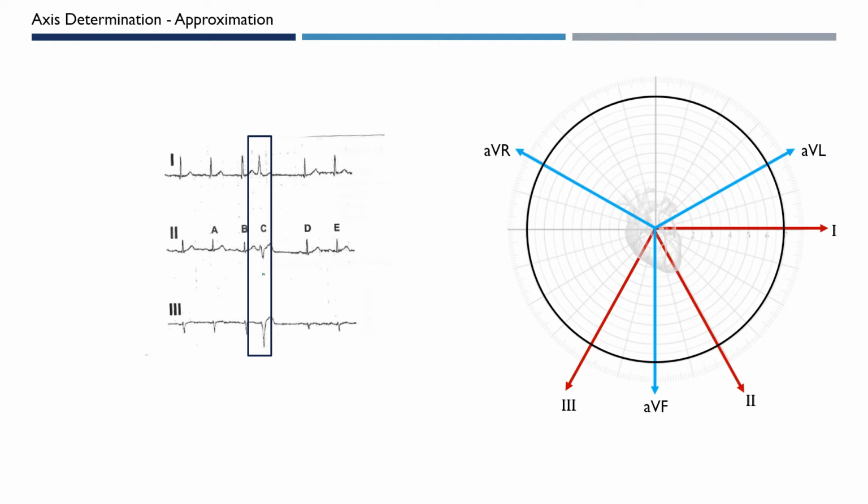we wouldn't want to come to that conclusion. The second approach, looking for large amplitudes, would lead us to conclude that lead 3 would be most indicative. Now, lead 3 has a fairly large amplitude in the negative direction, which would tell us initially that it's somewhere directly opposite from lead 3, because again, it's negative. So based off of just looking at this lead 3 peak, we can guesstimate that it's somewhere around the -60-degree mark. However, let's try and be a little more accurate.